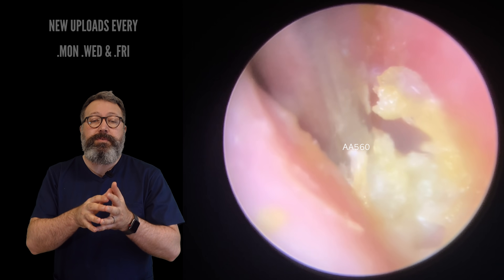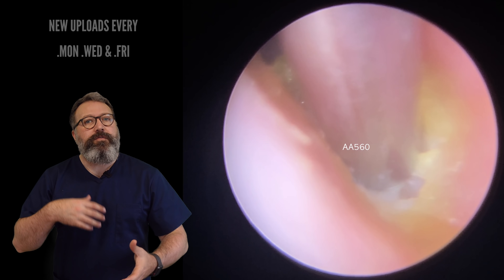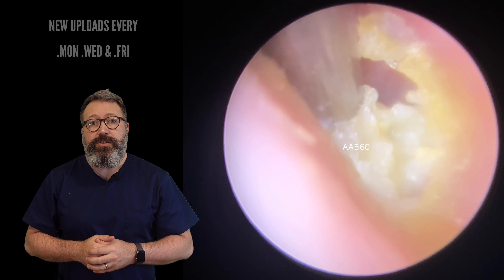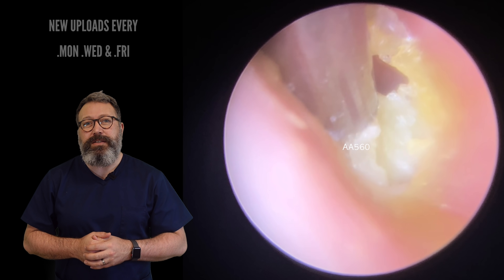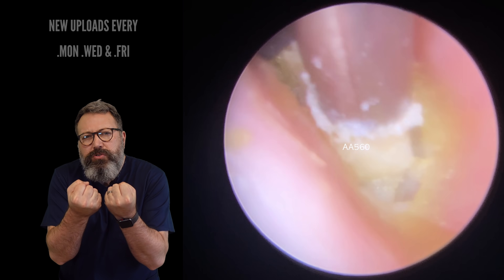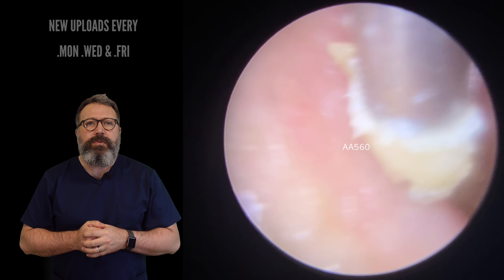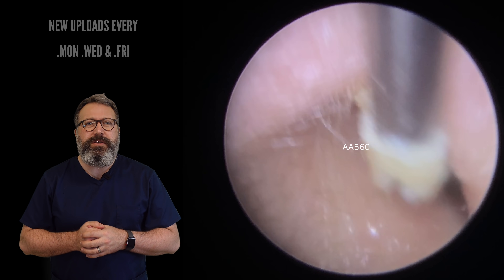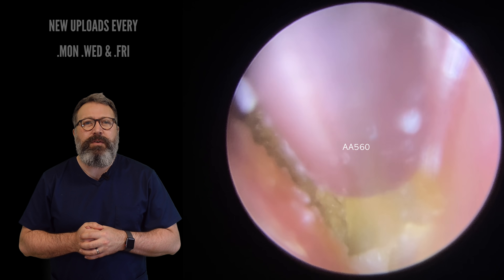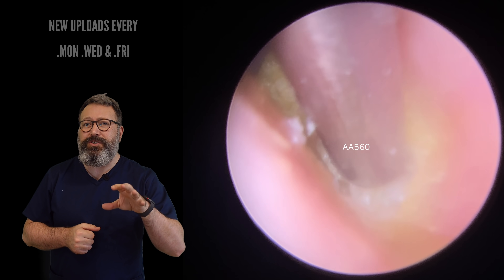So what happens here is when we clear the patient out, they're hearing really well. But after about 8 weeks, we get this skin build-up again and it has to be removed again. You can see it's very light in colour — sticky is the wrong word, it's kind of holding on to the canal walls really well. We're going to take all these smaller pieces away first, which is going to open up the ear canal, and then we're going to be able to see the eardrum.